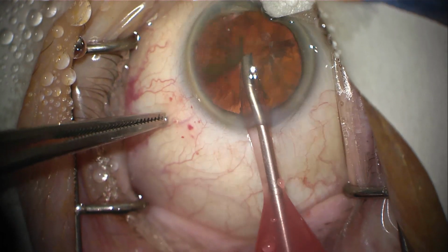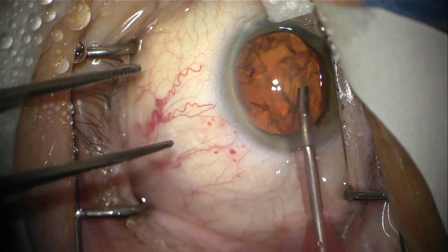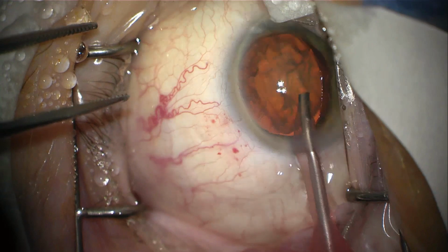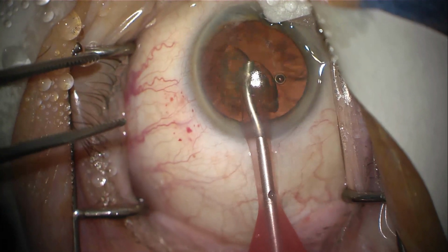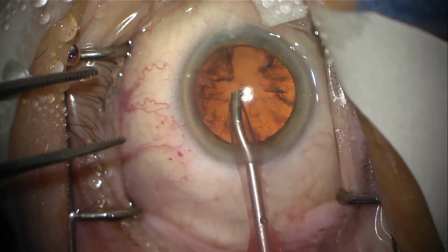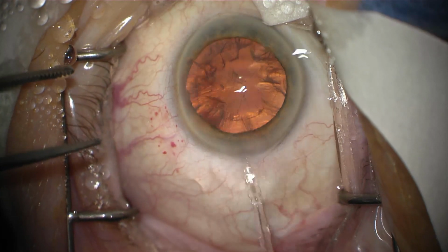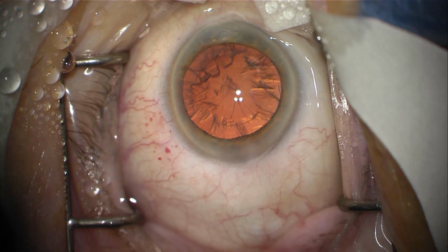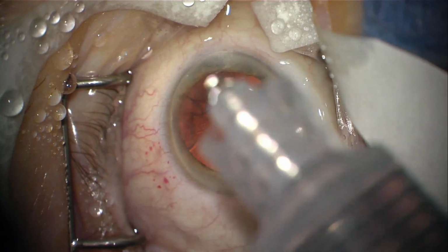I have to be extremely careful not to touch the cornea, not to touch the dilated pupil, not to touch the rest of the capsule of the cataract, because those structures are critical for the rest of the procedure, as you'll see. So now I've removed 100% of what's called the nucleus or the dense core of the cataract. What remains in the periphery or edges of the cataract is called cortex.